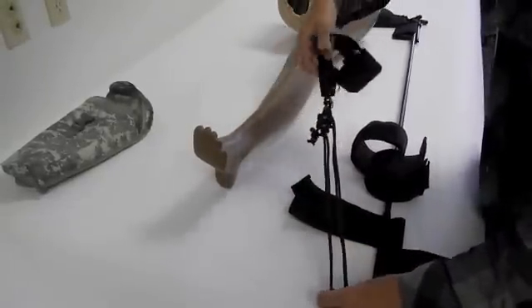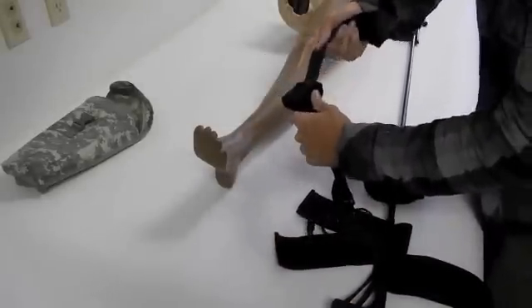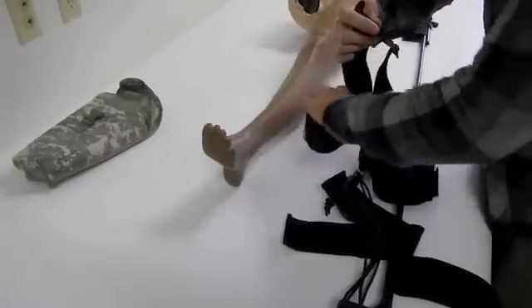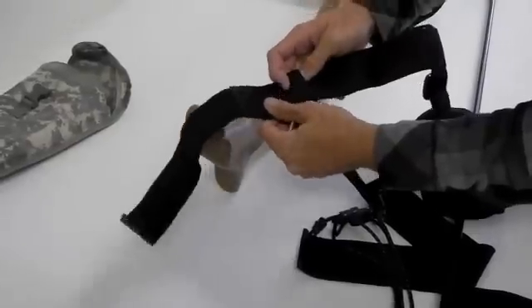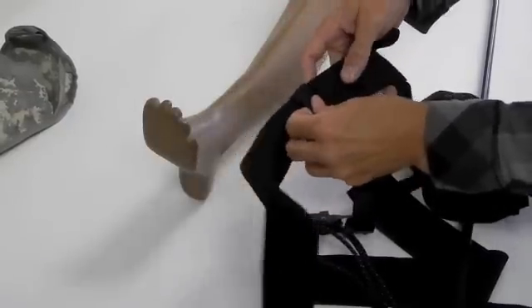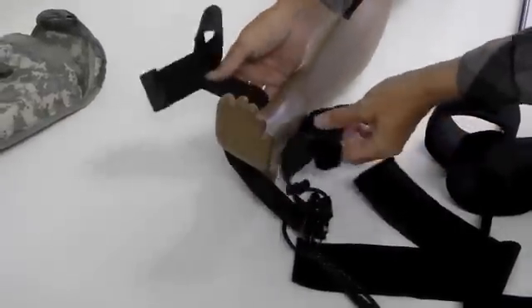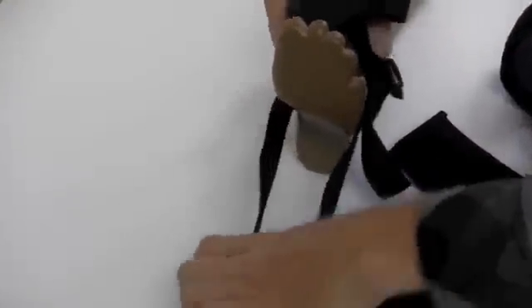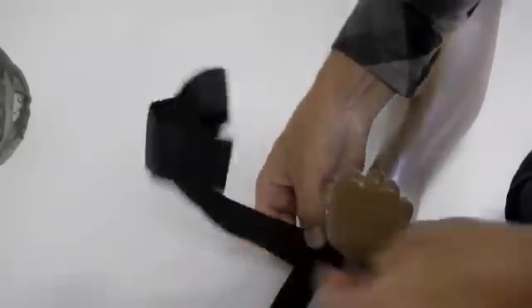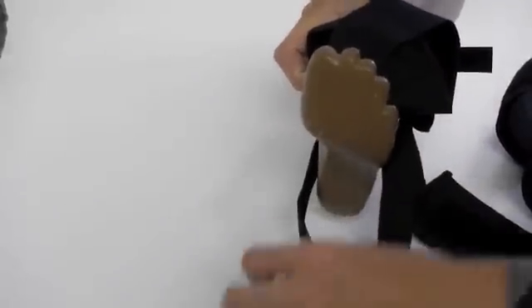There's no way any of this can get tangled. We'll go ahead and put the ankle hitch on first. You'll notice that one end you can slide so that it will accommodate a large boot or a small pediatric patient, and you can still get good alignment on both sides of the ankle. We have a smaller patient here, so I'm going to move this anchor down so that it's even on both sides of the patient's foot so the traction is in straight alignment.